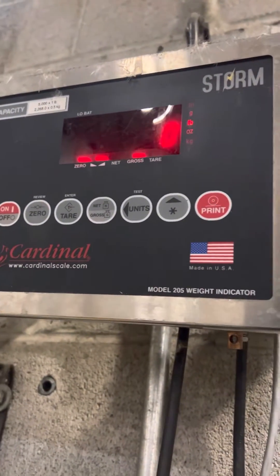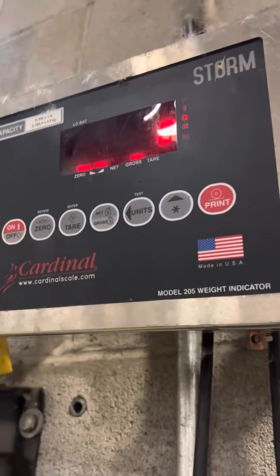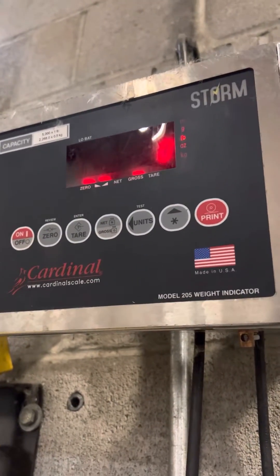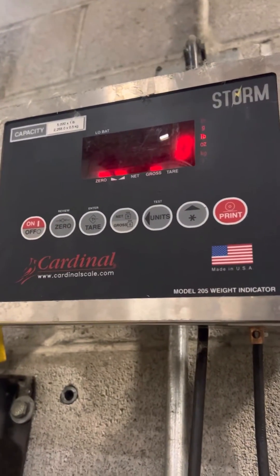This is a calibration adjustment of a Cardinal 205. I had originally already posted a video on this, but I realized afterwards that the steps were kind of off.